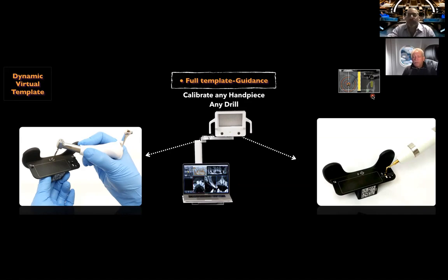But what we have seen, Isaac and myself, at our live surgical courses, where we've been integrating dynamic navigation with some of the participants doing it for the first time, it's really amazing how right on they are on their very first case. So although there is a learning curve, it's going to be based upon your own hand-eye coordination and surgical skills, and you can in fact get it even on the first try.